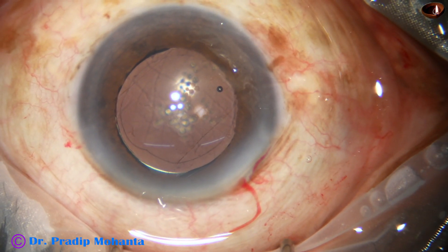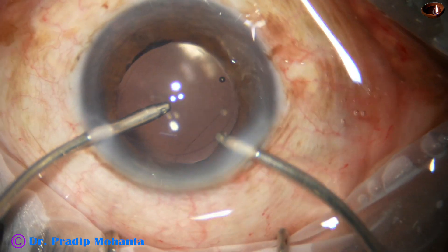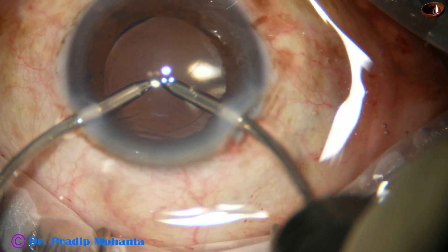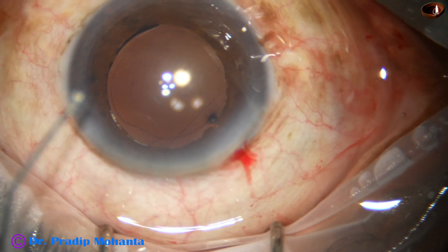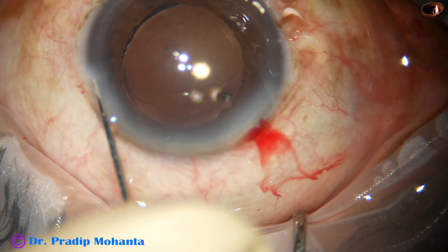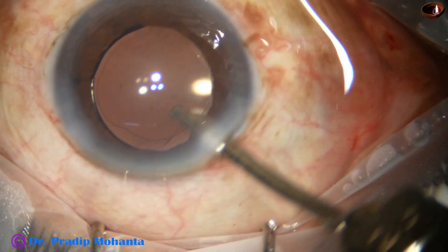Now I am going to use bimanual irrigation-aspiration. This is the bimanual irrigation aspiration — the irrigation goes behind the lens and aspiration is above the lens. All the visco in the anterior chamber and in the bag is removed.